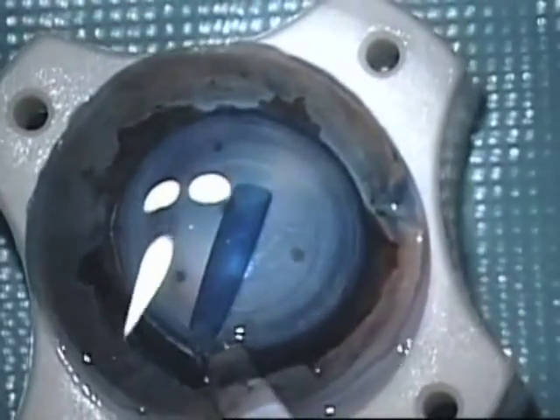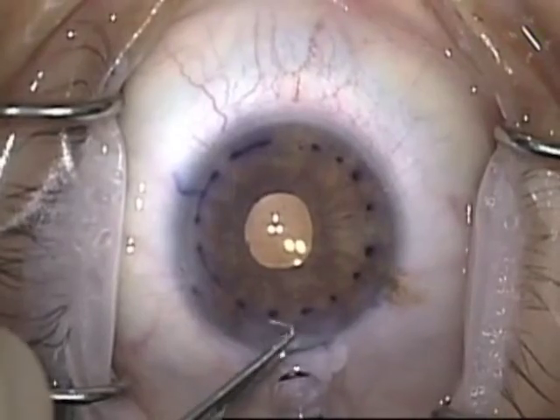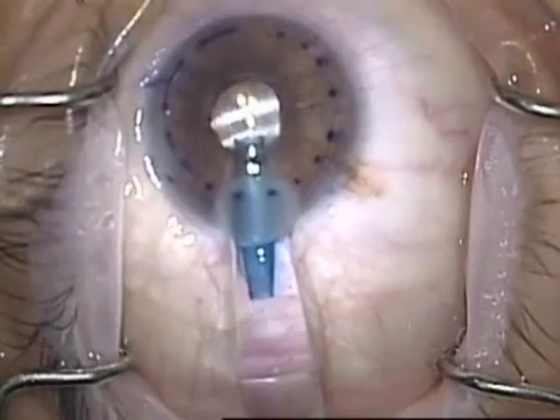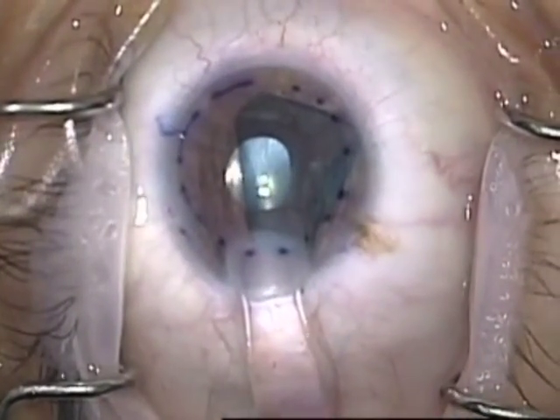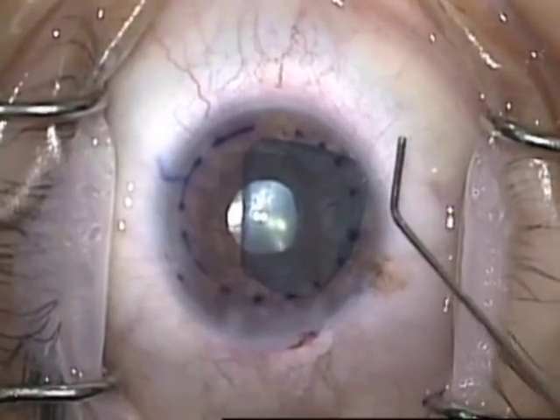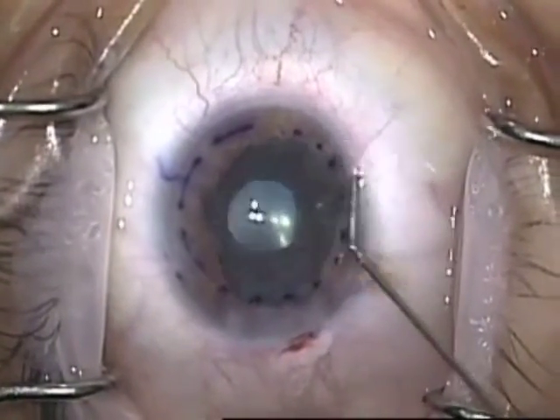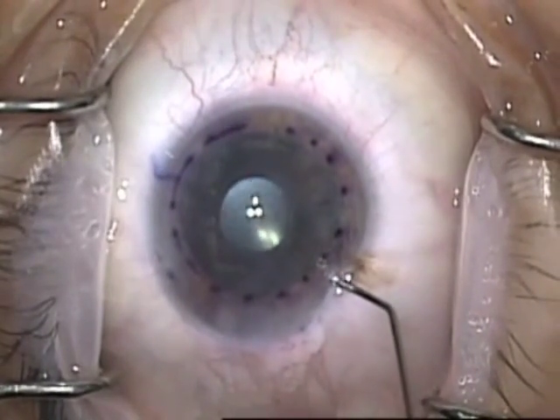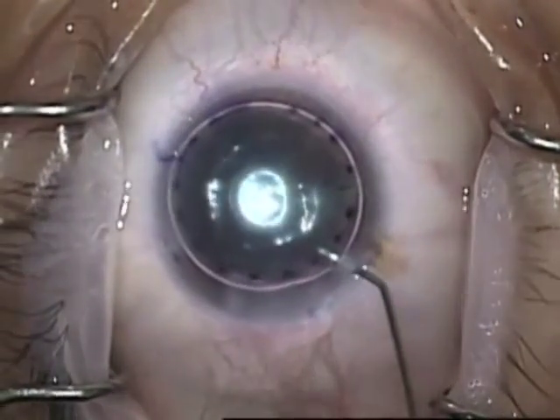Once it's freely floating, I gently aspirate it into the Stryko DMEK injector tube, which has polished glass edges that are safe for the graft. Then I inject the graft into the patient's eye, making sure not to overpressurize the eye because I don't want the graft to shoot back out. I depressurize via the paracentesis and remove the injector. The graft is in a fairly floppy but almost perfect position, so I proceed with tapping it into position and lock it in there with 20% SF6 gas.